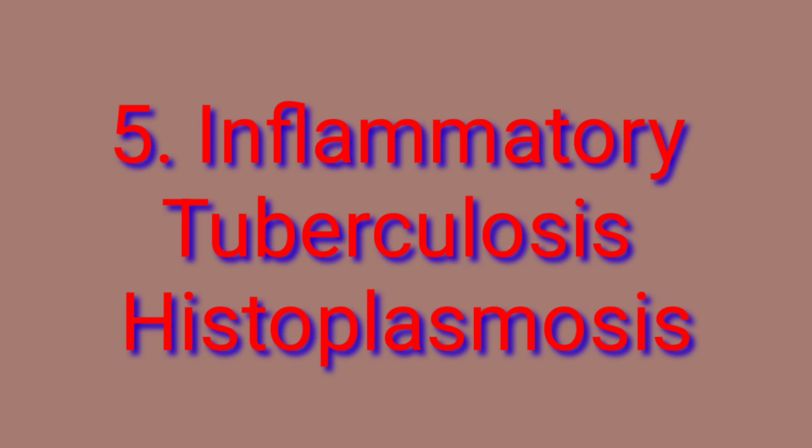Or there may be another infection, histoplasmosis, which will also turn into calcification. So you must include inflammatory conditions while you are reporting adrenal calcifications in adults.